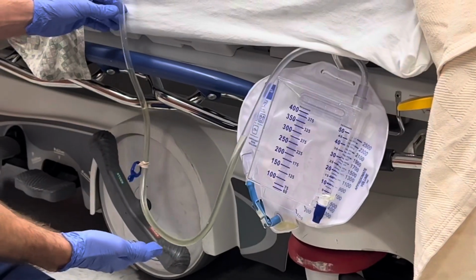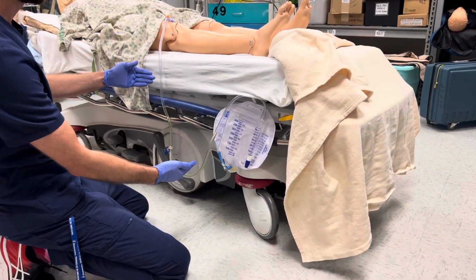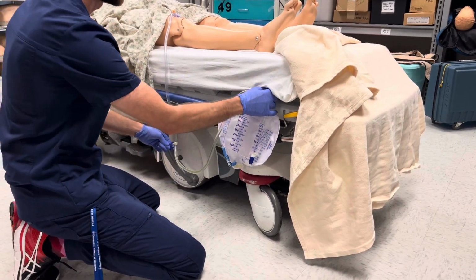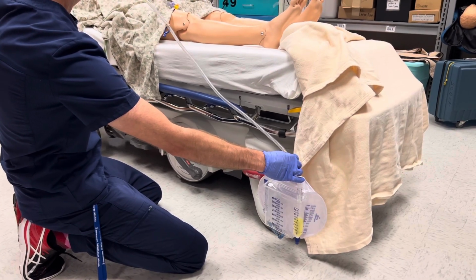This is a dependent loop, and while seemingly harmless, the stagnant urine promotes bacterial growth and colonization of the intraluminal wall of the drainage tubing. Then backflow of urine into the bladder can actually start an infection. So always keep the drainage tubing clear of urine.